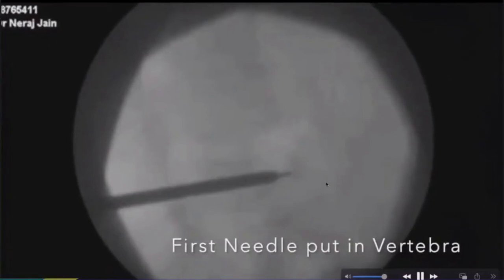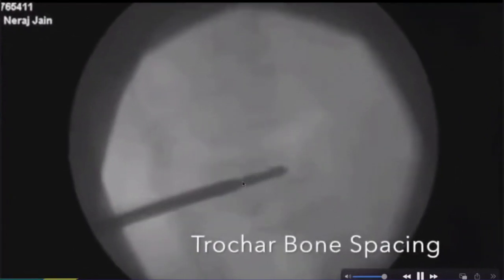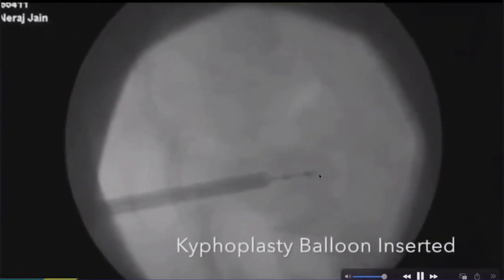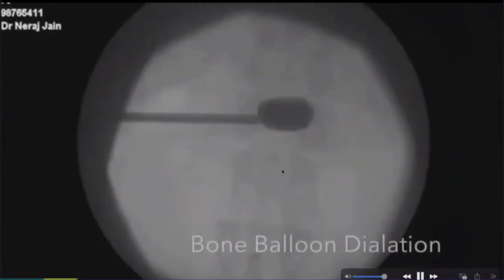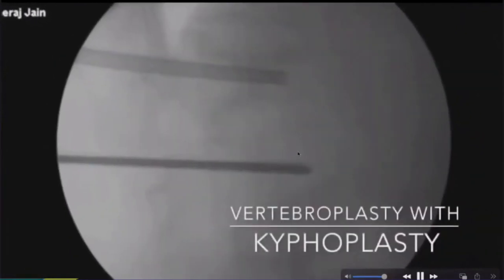Now this is the first needle in place. We put in a trocar, make a space for the balloon first. Once you make a space for the balloon, take the balloon in there up to the anterior margin or mid-vertebral body, depending upon where you want to keep it, and you want to elevate the end plate. And that's how it looks when you inflate the balloon. It is elevated around, and then this is one vertebroplasty, one kyphoplasty. So this is the kyphoplasty.